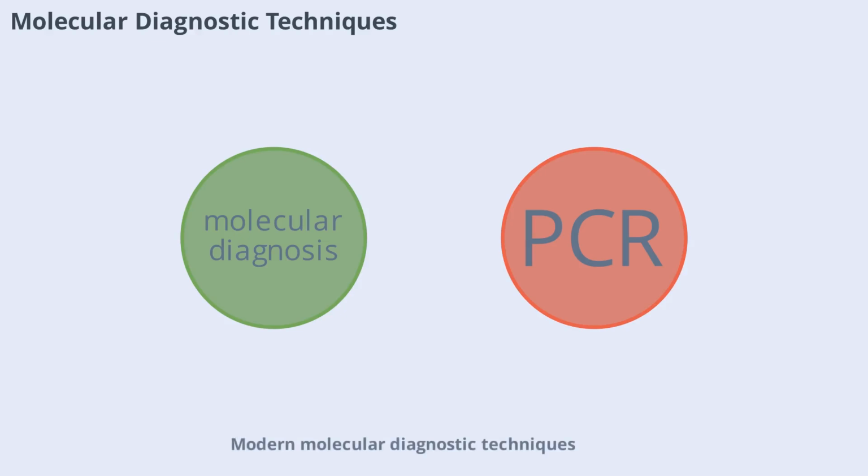Modern molecular diagnostic techniques such as PCR with sequence-specific primers and gene sequencing have revolutionized blood group identification. These methods allow for precise detection of rare subtypes like Am, providing information that cannot be obtained through serology alone. In this case, molecular testing was essential for confirming the diagnosis and guiding treatment.